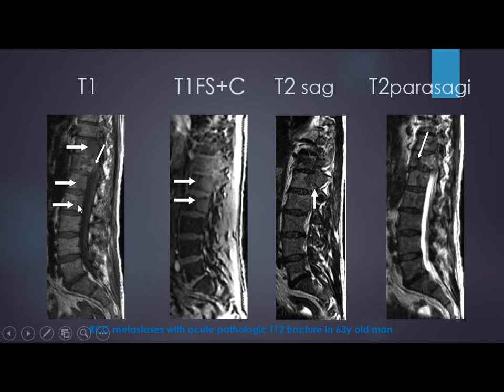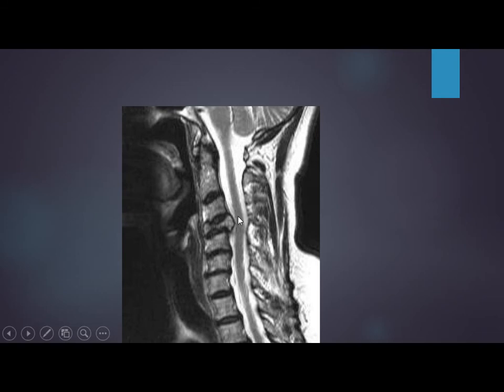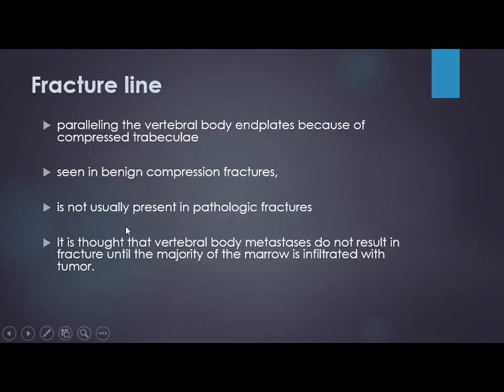In this patient with multiple metastases, there are expansile lesions at L1, L2, T11, and pathological fracture of T12 — it is bulged and infiltrated, compressing the spinal cord, with the pedicle also involved. There is usually no fracture line because all trabeculae have been destroyed and infiltrated — fracture in metastasis does not occur until late in disease when trabeculae are fully destructed. We see decreased height, posterior bulging, and no fracture line — this is regarded as pathological fracture.